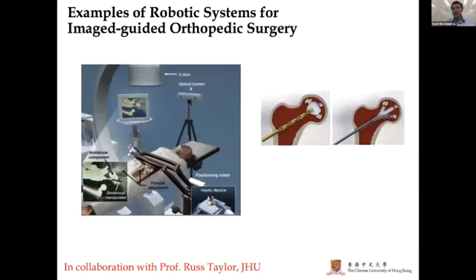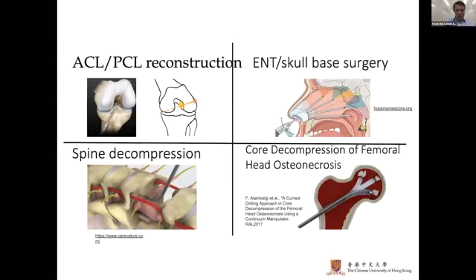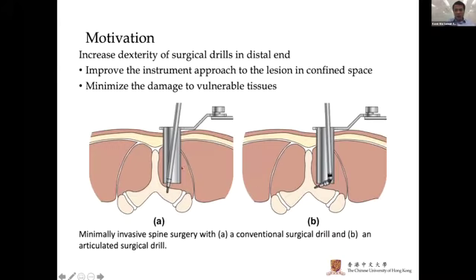Other than the new form of organ retraction, we are also working on a new type of orthopedics tool that is different from what we have right now. One of the things we found is that traditional orthopedics tools are all rigid. In particular, for spinal surgery, if you have a rigid tool, you cannot reach the edge tissue easily. But if you have an articulated tool, then it will work. But nowadays, there are few articulated drilling systems or articulated debridement systems on the market.